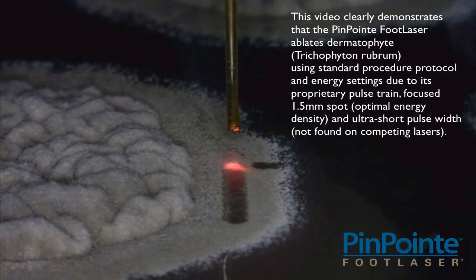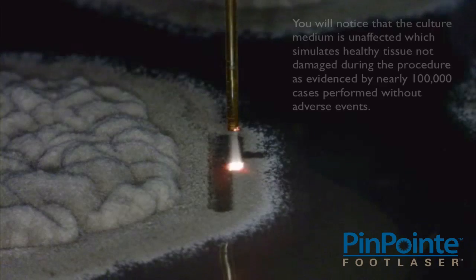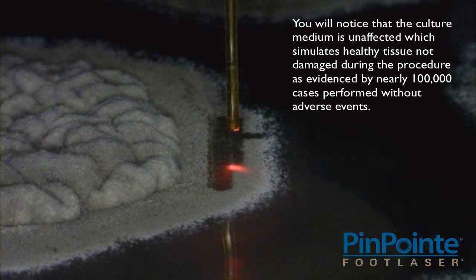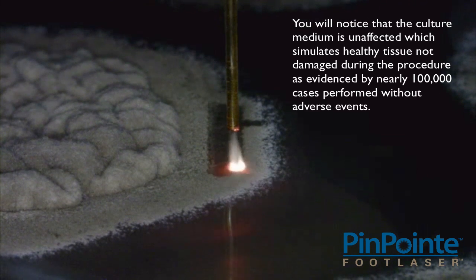With optimal energy density and ultra-short pulse width not found on competing lasers, you will notice that the culture medium is unaffected, which simulates healthy tissue not damaged during the procedure, as evidenced by nearly 100,000 cases performed without adverse events.